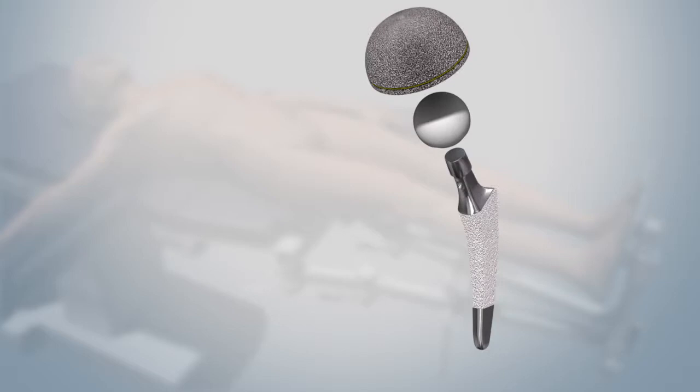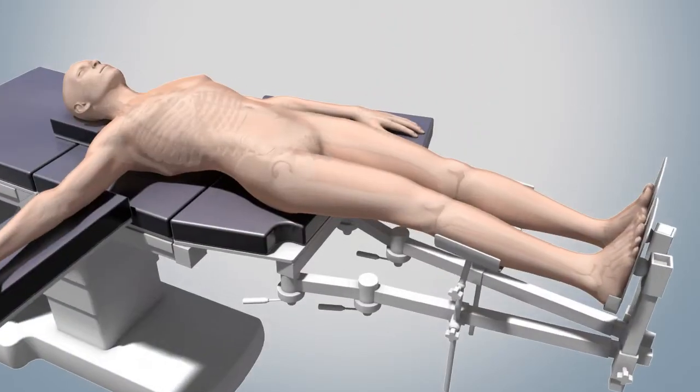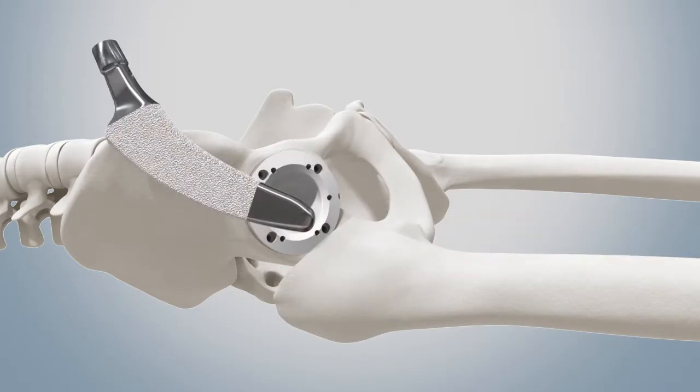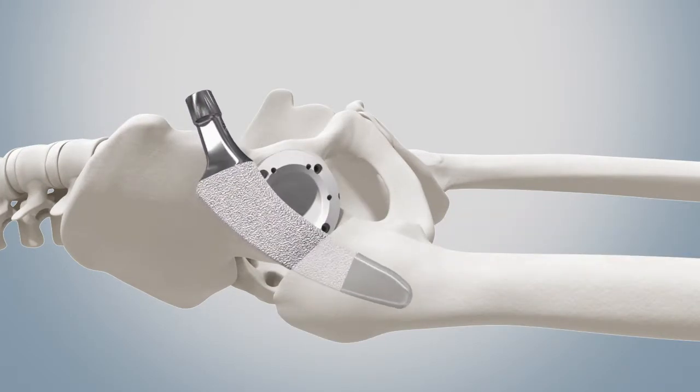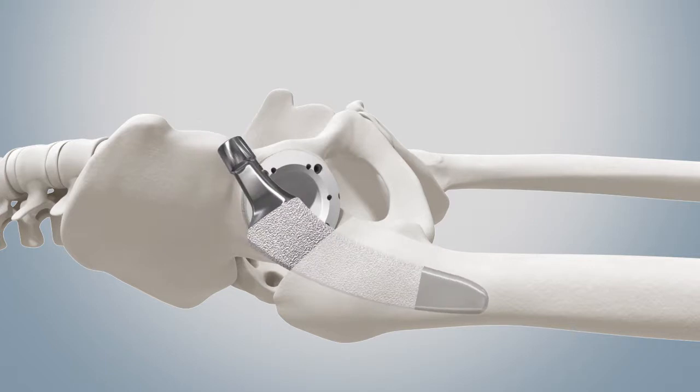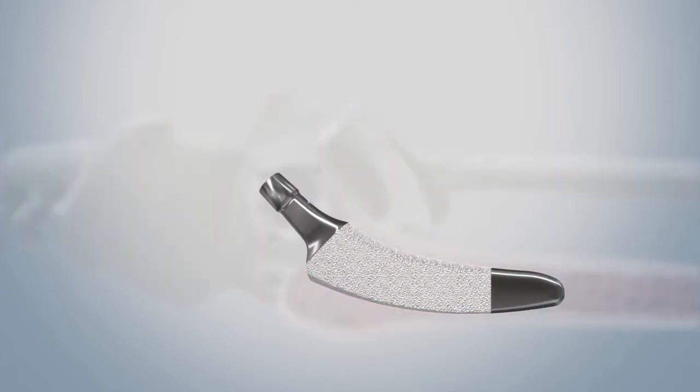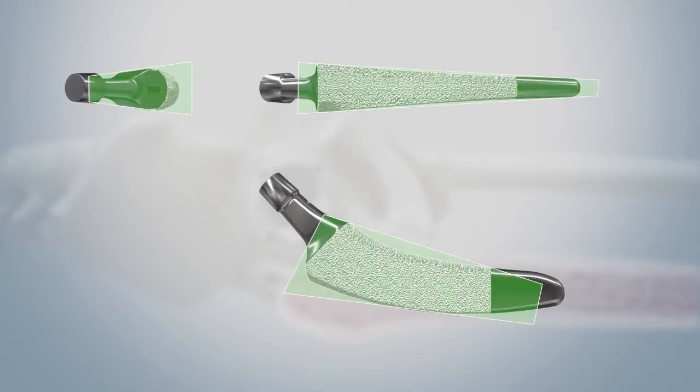These are uncemented implants, meaning they do not require any fixation involving cement. The primary fixation of these uncemented implants takes place via press fit anchorage, in which the so-called primary stability is achieved already intraoperatively by forceful impaction and chalking of the appropriately wedge-shaped components.